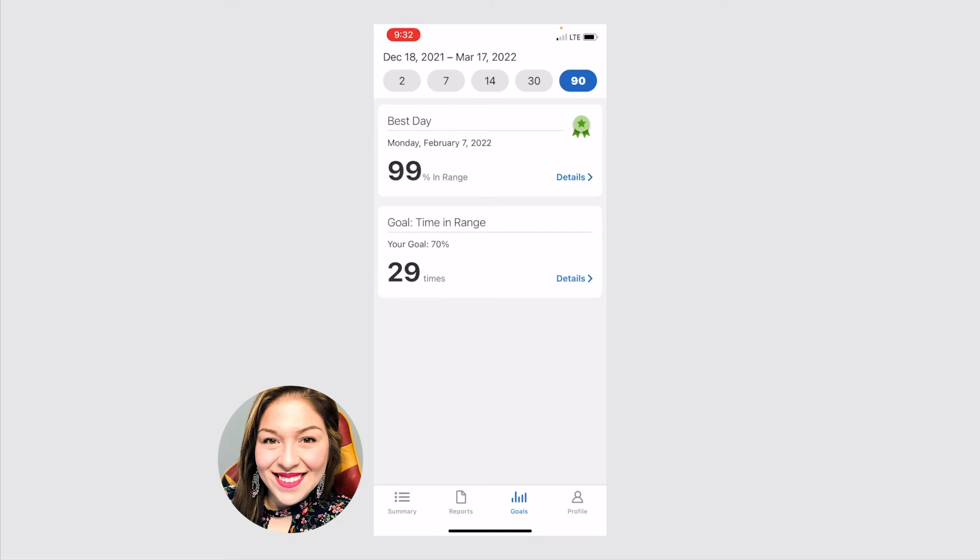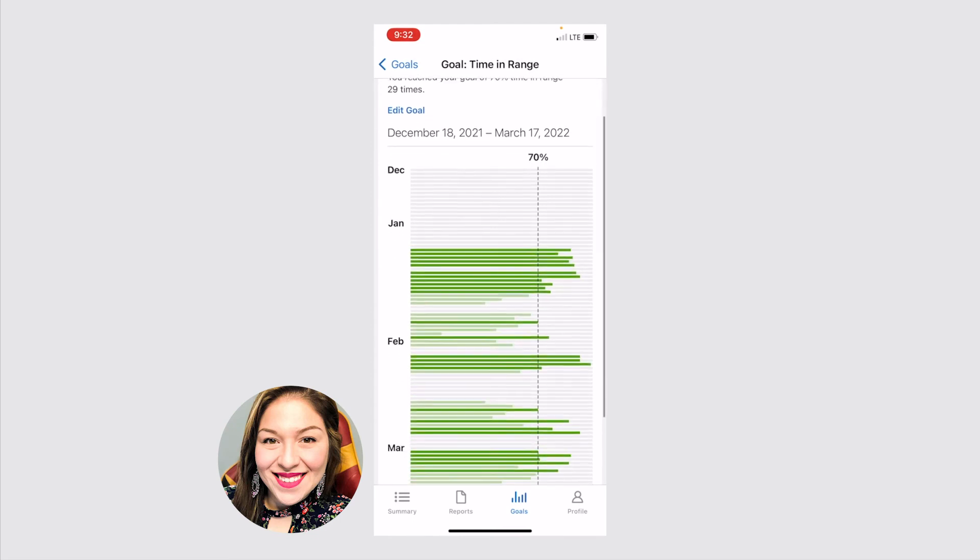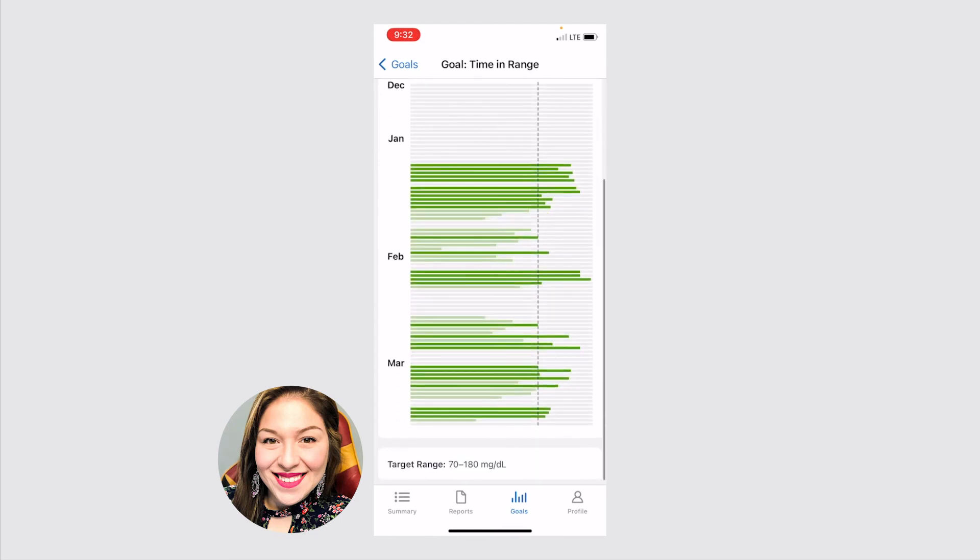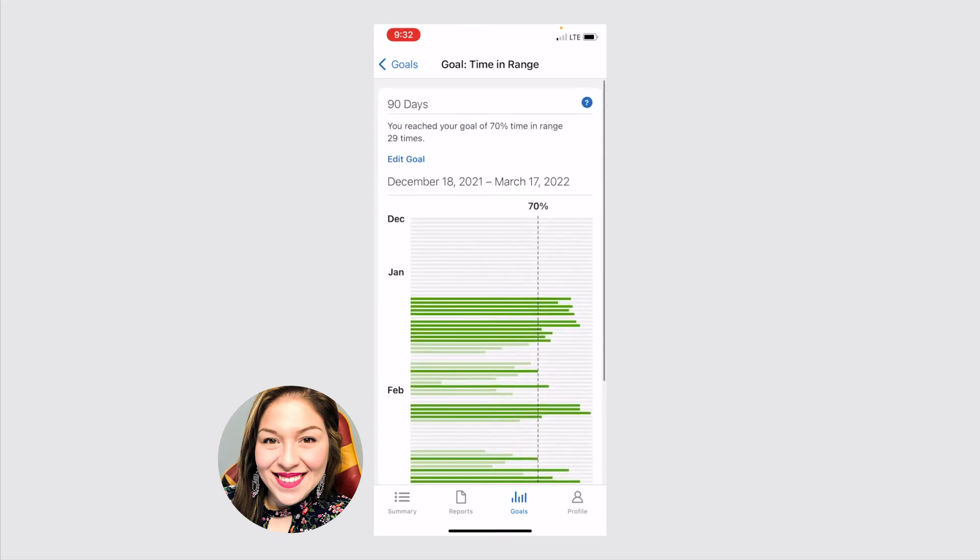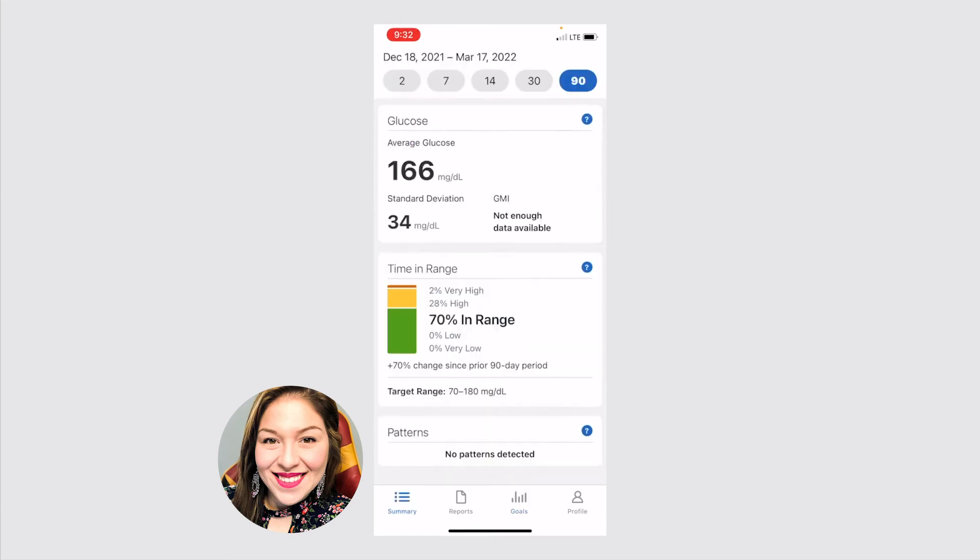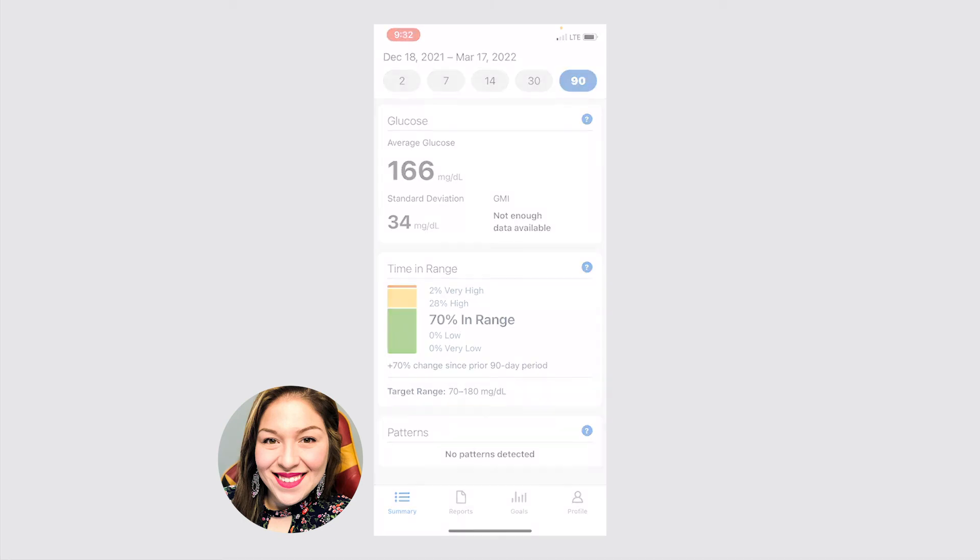If you click on details, it shows you here for the past 90 days, each line, whether you were within that range or not. So that's kind of the gist of the clarity app. It's a great way to kind of look back and see how your blood sugars have been doing and how your diabetes management is going and make any adjustments if you need to.